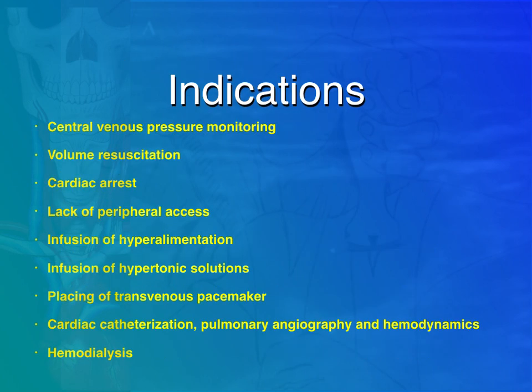There are many indications, but not only: central venous pressure monitoring, volume resuscitation, cardiac arrest, lack of peripheral access, infusion of hyperalimentation, infusion of hypertonic solutions as well as pressors, placing of transvenous pacemaker, cardiac catheterization, pulmonary angiography, and hemodynamics, as well as hemodialysis or plasmapheresis.